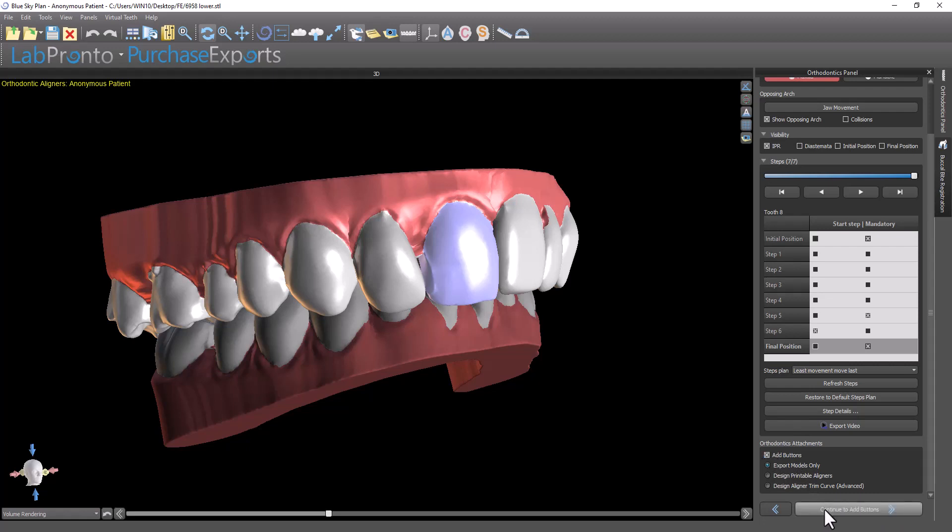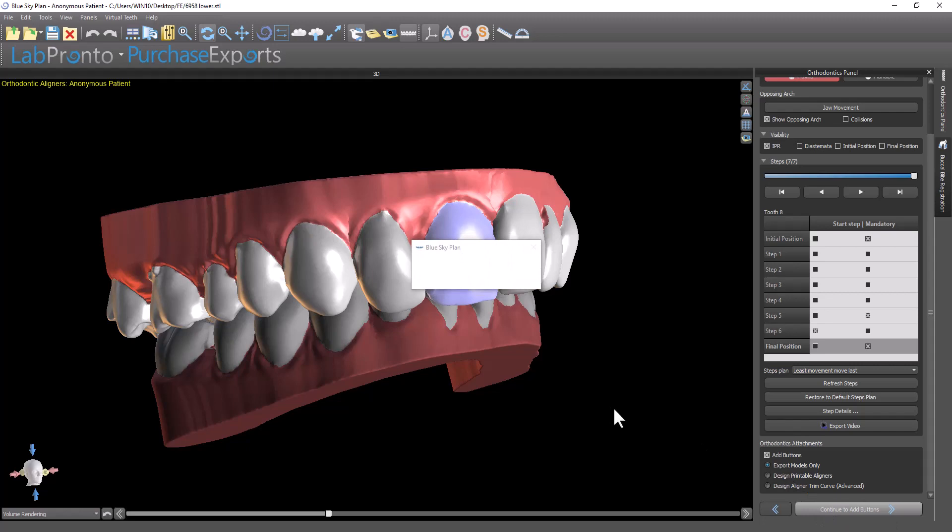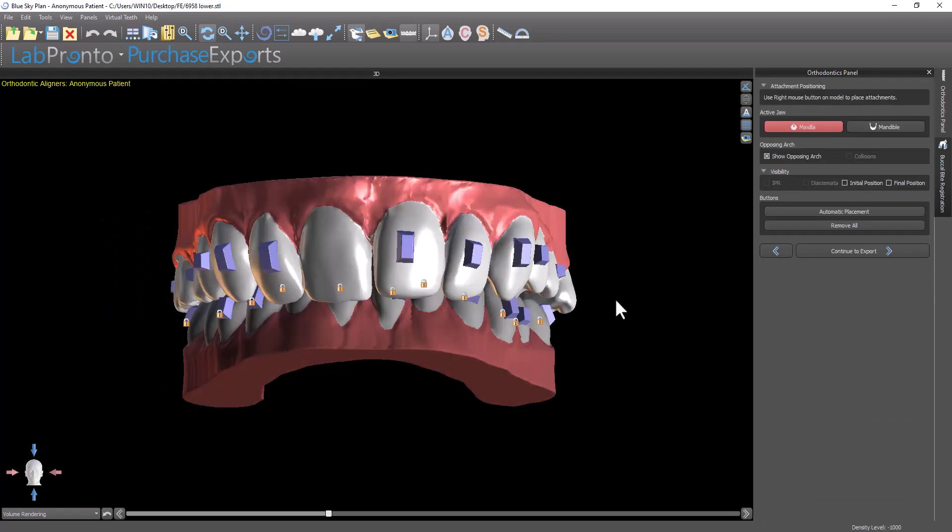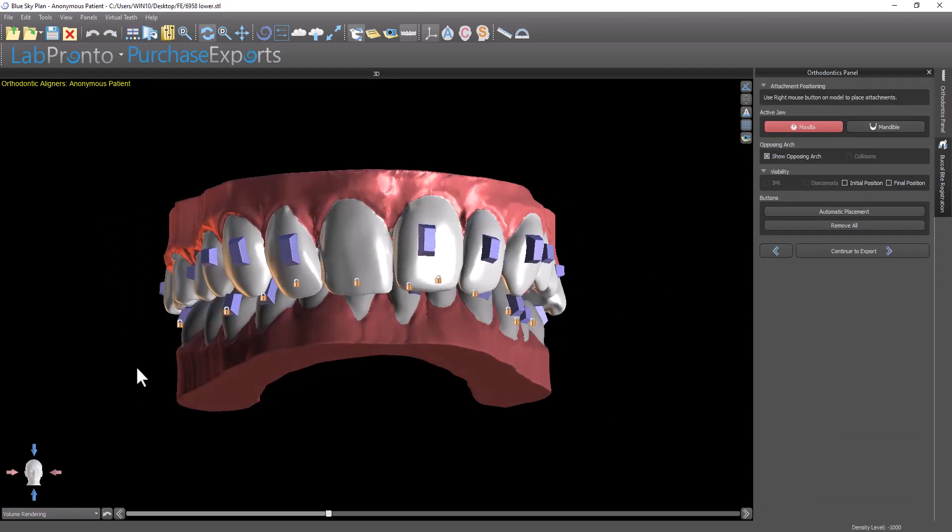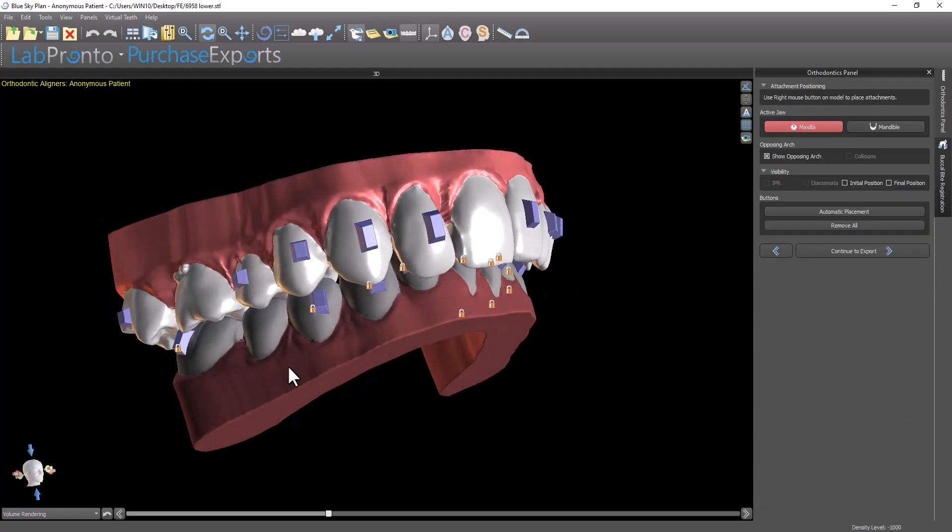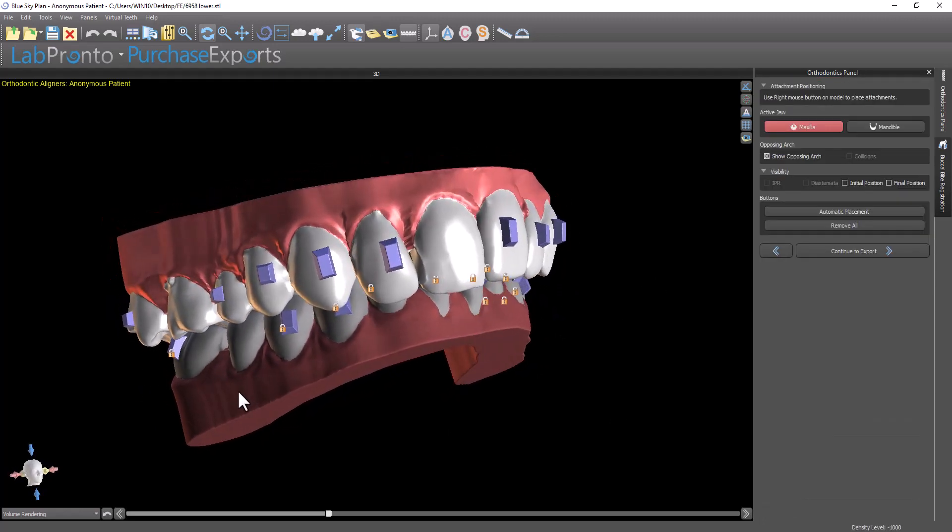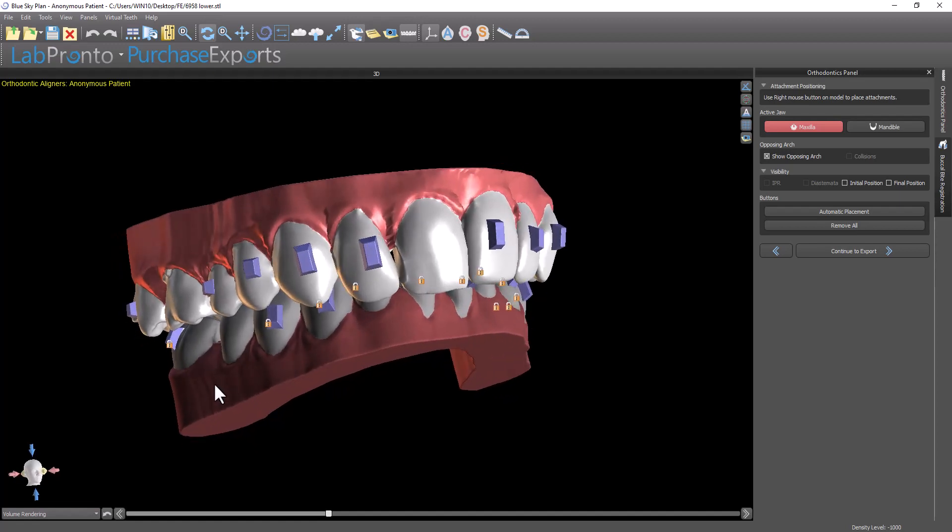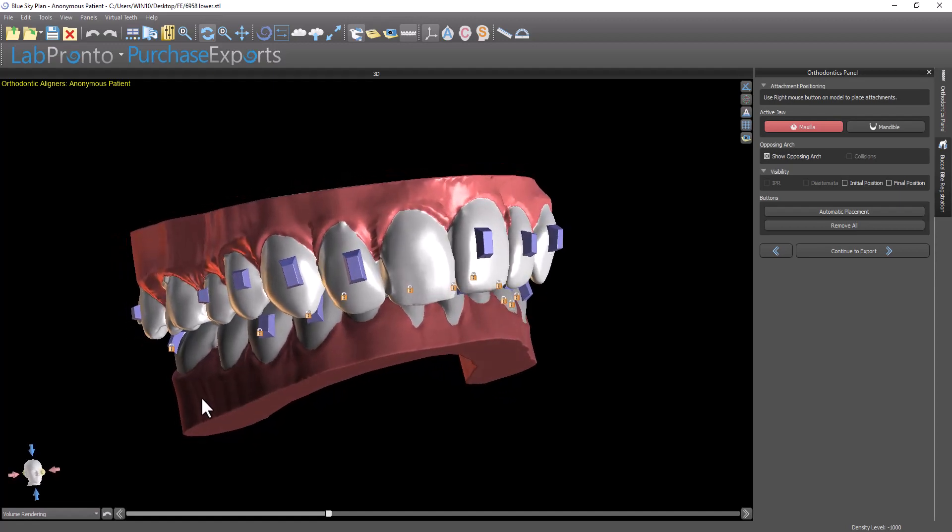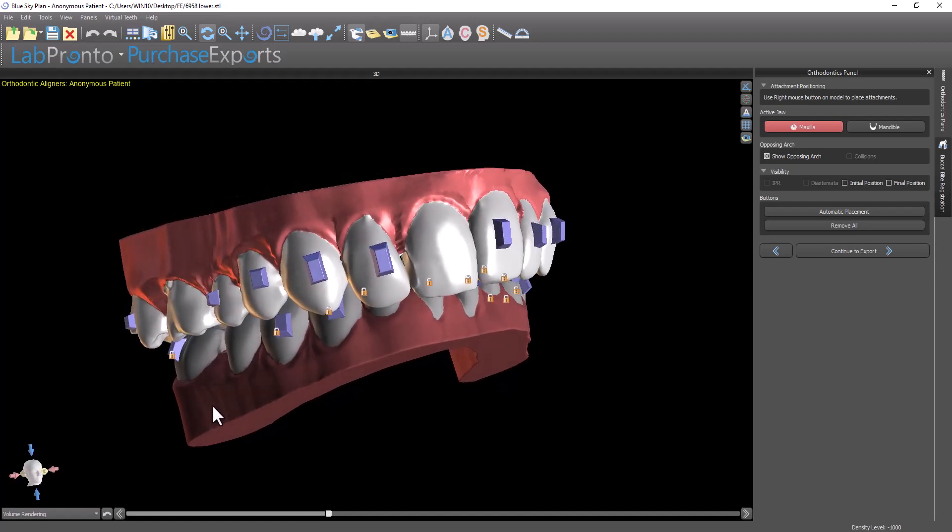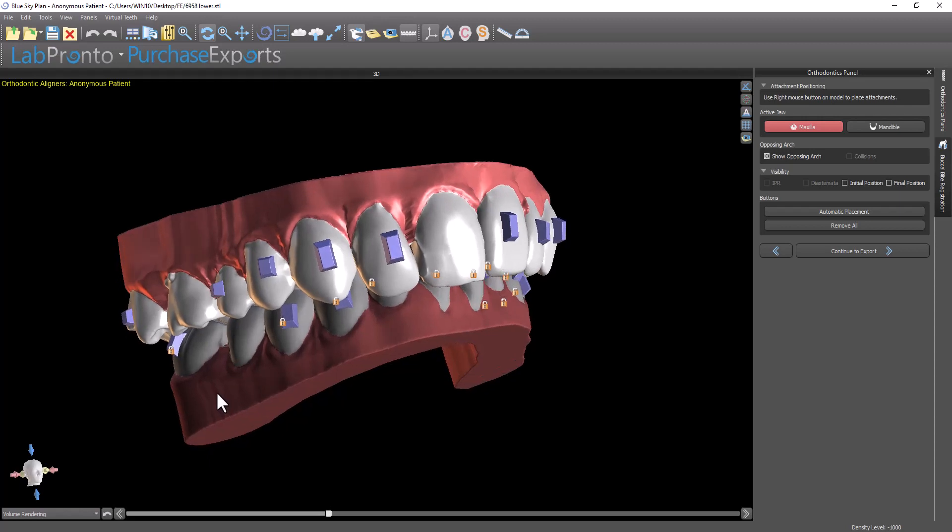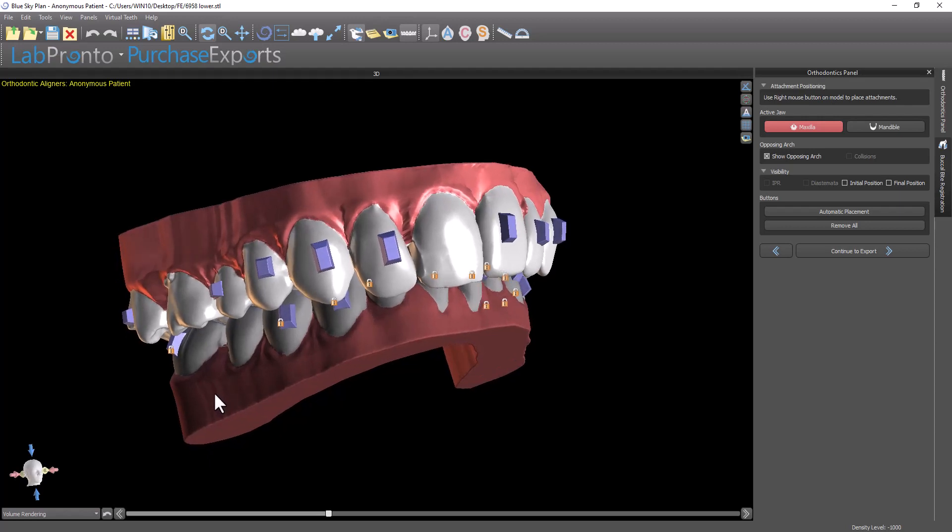The software takes us to the next step and we can see that the buttons have been placed automatically based on the movement of the teeth. The software determines where the buttons should be placed based on the tooth movement steps and has added the buttons.